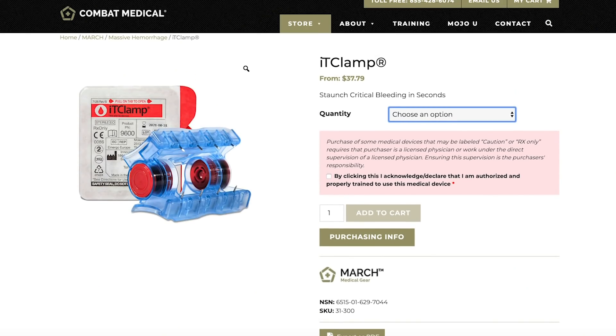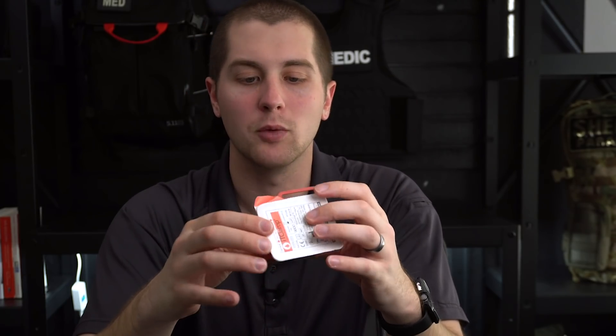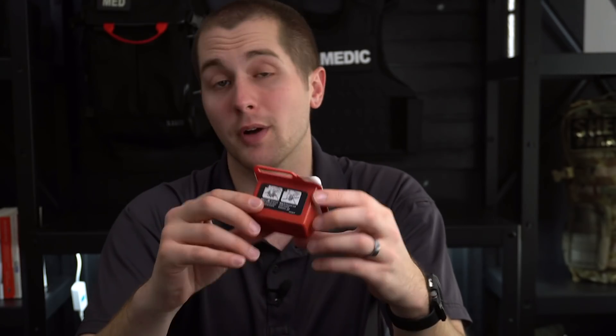All in all, this will cost you about $37 for one. It comes in this packaging here, so it's not the smallest thing ever — it's not going to fit on your ankle IFAC or anything like that — but it will be an interesting addition to your kit. It's definitely something I'd recommend checking out if you need to easily clamp a neck wound or a head wound. One additional potential issue is that once you apply this to somebody, it sticks out. So if you put this on somebody's head and it gets bumped, it would be really easy to rip this out of the skin — something to look out for.